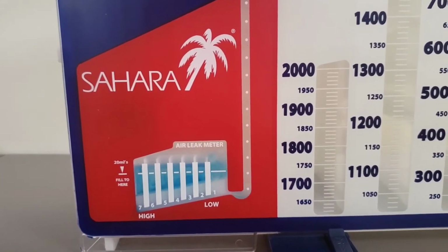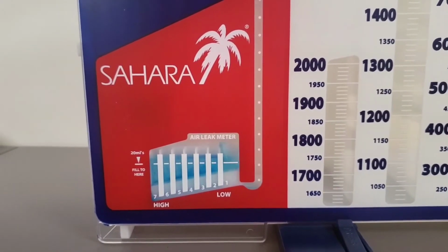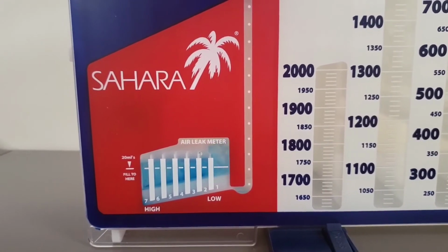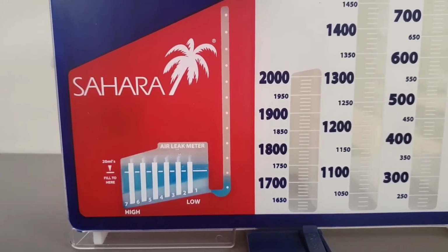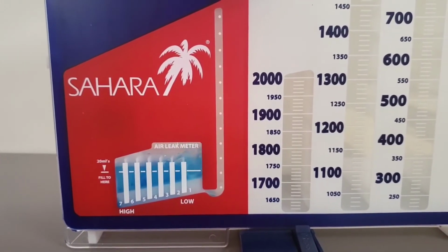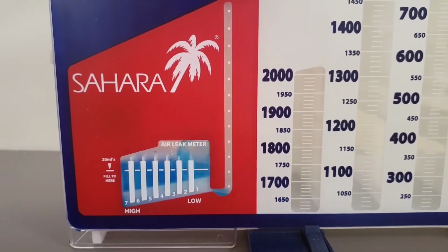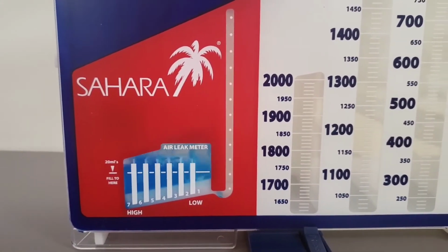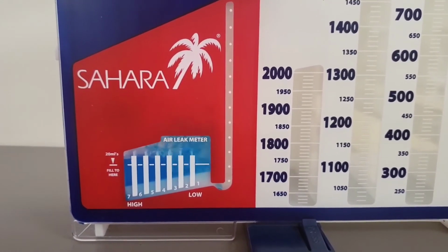Tidaling with inspiration and expiration is to be expected, but if you have continuous bubbling in the air leak meter, this would be indicative of a low air leak. As you can see, chamber 1 has continuous bubbles. If there's a moderate air leak, you'll see continuous bubbling through multiple chambers like 3 and 4. With a high air leak, all of the chambers will have bubbles, 7 out of 7, high air leak.